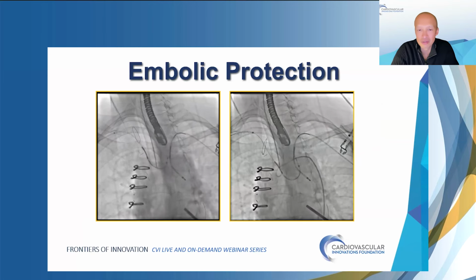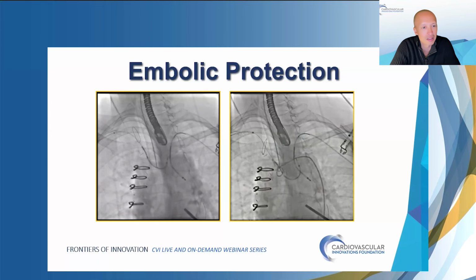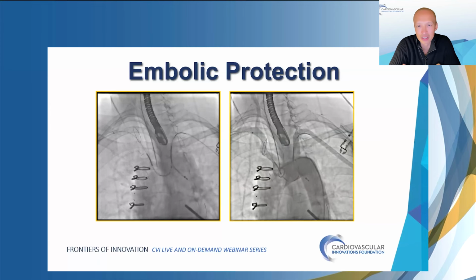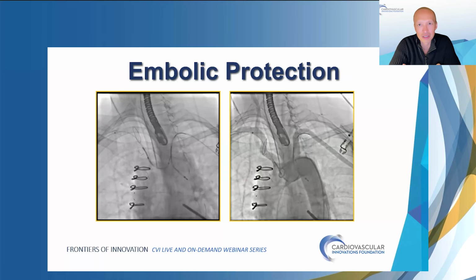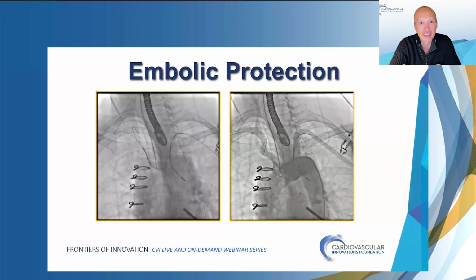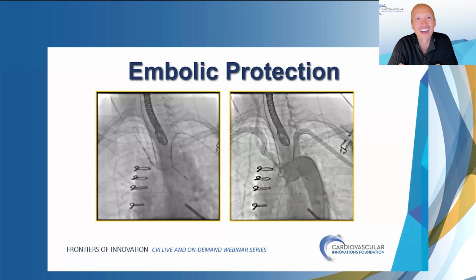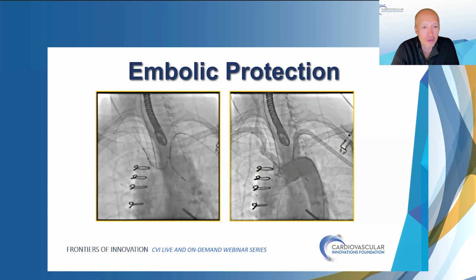So it was one of these situations where I went up to meet the patient, and I looked at the patient. I thought, you know what? I really need to do whatever I can to reduce the risk of stroke. Strokes have already happened. I looked at the arms. I said, well, guess what? You're getting a Sentinel on each arm. And they said, thank you. Because we talked about it, what are we doing here?